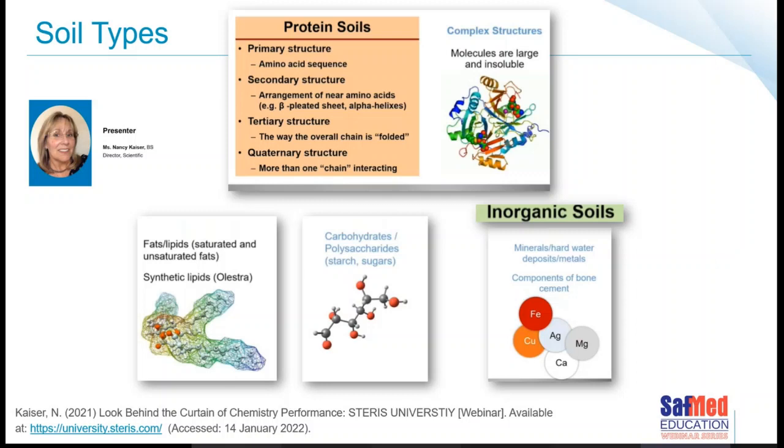The contaminants in your hair that your shampoo needs to break down are different, and all of those are different to the soils that a surgical instrument is exposed to. So we use specific chemical formulations depending on the type and nature of the soil that needs to be broken down. She went into great detail about fats, lipids, and carbohydrates and the various molecular structures and bonds that hold them together. A little bit past my skill level, but I got a little bit of understanding, and that's what I'll go on to describe now.